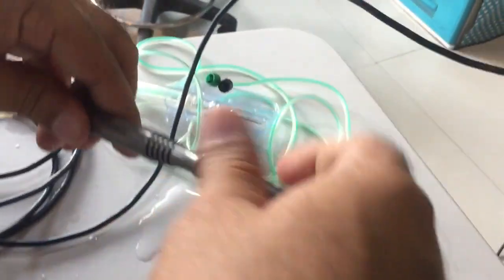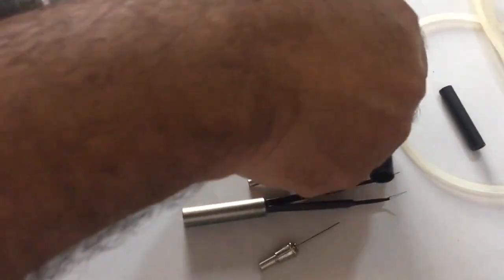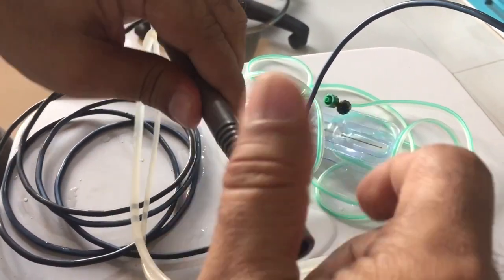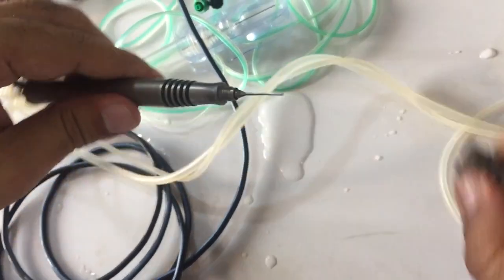Then you open the cap of the handpiece. Here is the regular tip inside. This is the protector with tip. You mount the tip on the phaco handpiece and you tighten it with the regular key. You press it this way and then you mount like this. So two forces, one is in this way and the other is in this way.